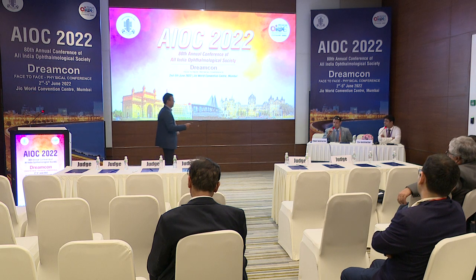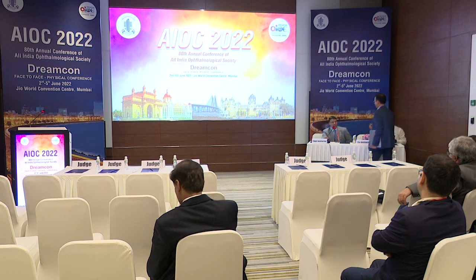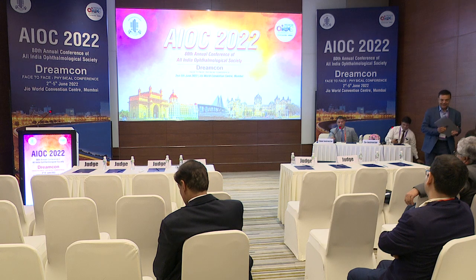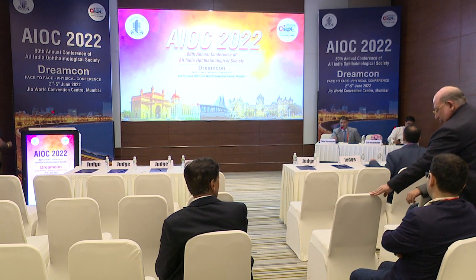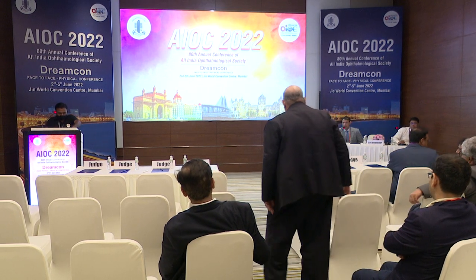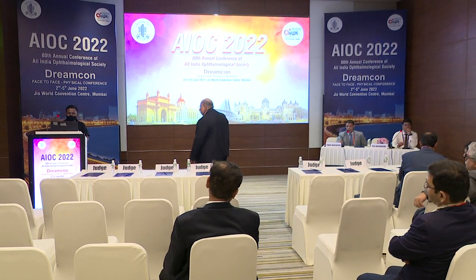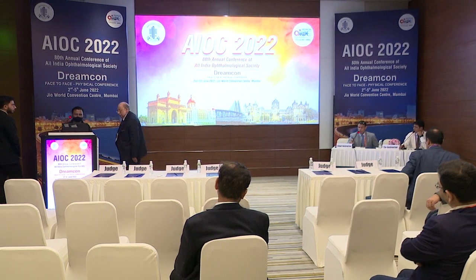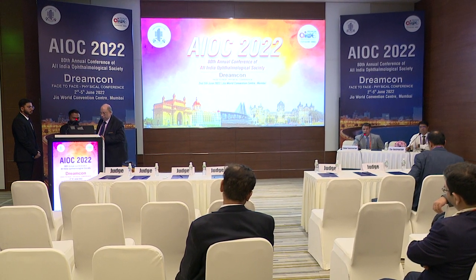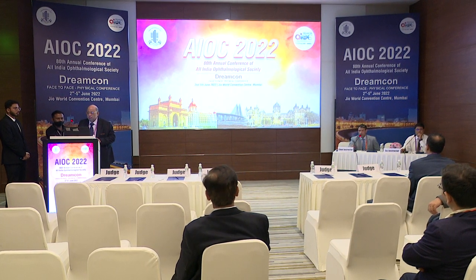Since you are the leader of the hooks and rings, I thought that you could really do justice to this topic. Next, we call Professor Keiki Mehta, the pioneer of lens implant and phacosurgery in India, to teach us about, I think, femto and hard cataracts. So the question is now, everybody wants to buy a femto laser, everyone wants access to it. Is it really a useful tool, or is it just an expensive toy to attract patients? So let's see what Sir has to say about it.